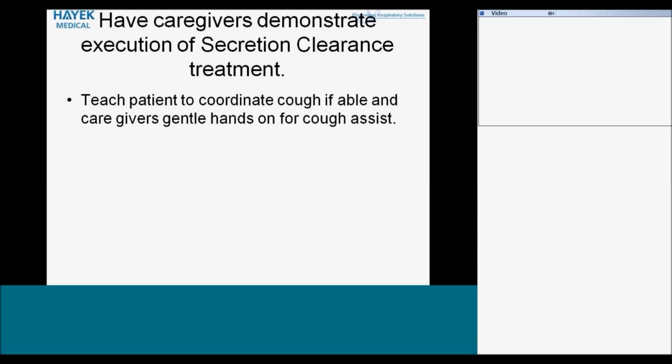And there will almost always be some leaks around the edge of the cuirass during the cough assist cycle, but if you go ahead and give the patient some assistance, you'll seal up some of those leaks, and you'll get a little extra pressure, a little extra push during the assist cough phase, and that will help the patient generate greater flows.